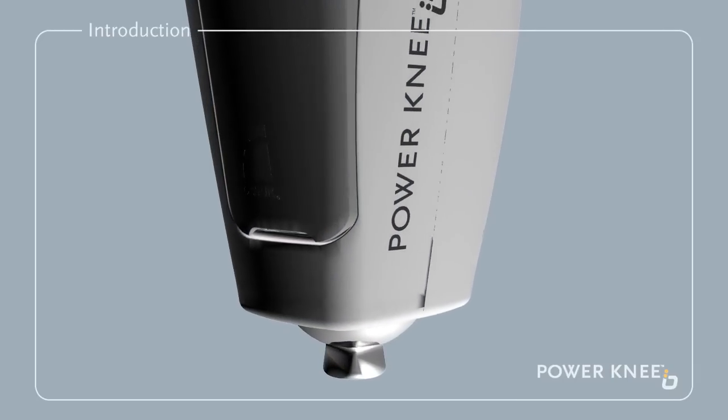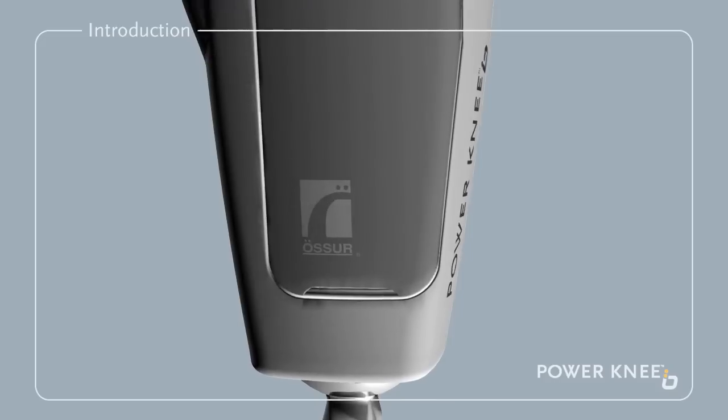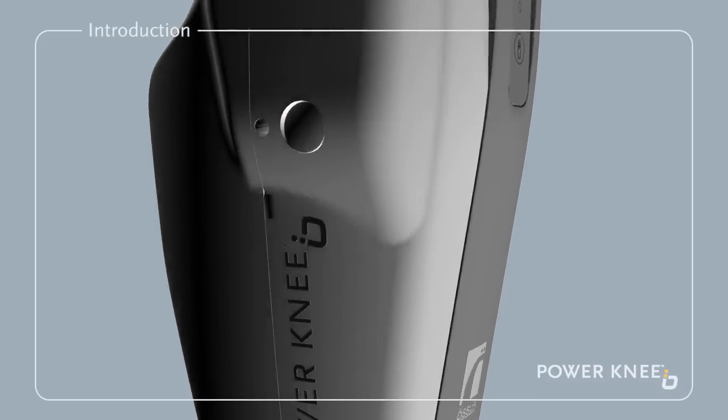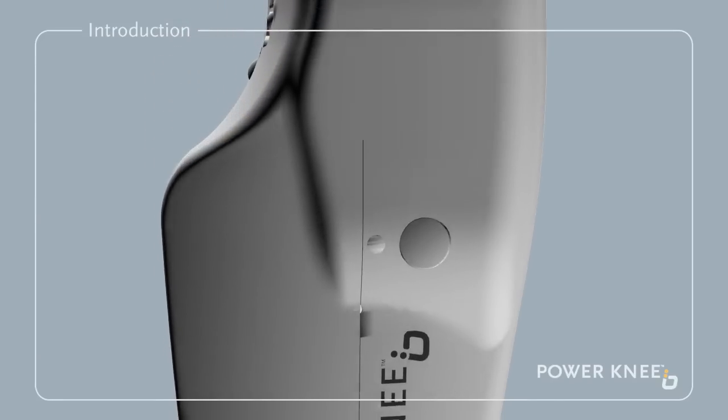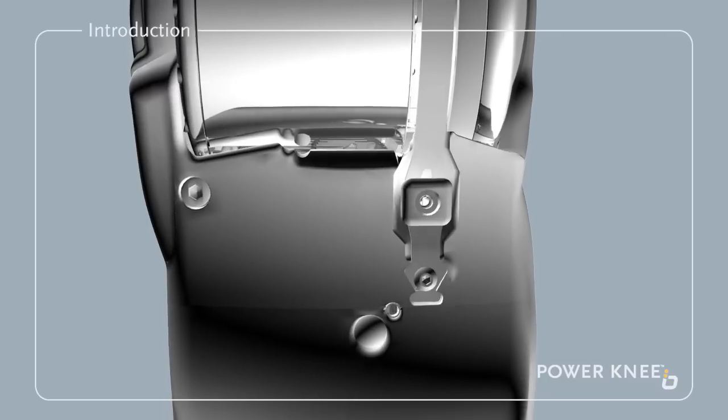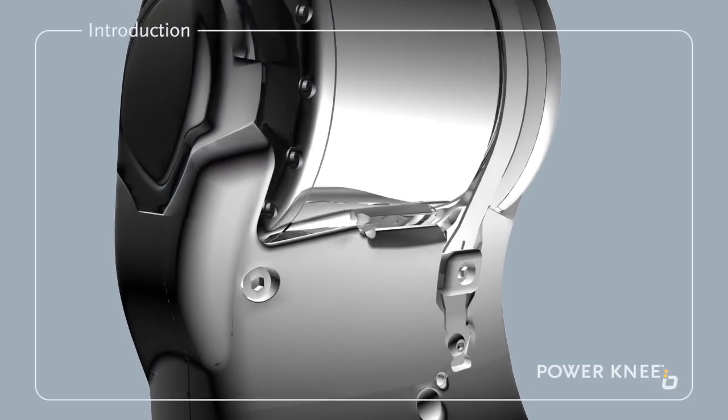Congratulations, you are now the owner of a new Power Knee from Ossur. This second generation bionic motorized prosthesis for above-knee amputees offers unprecedented performance and flexibility for everyday activities.